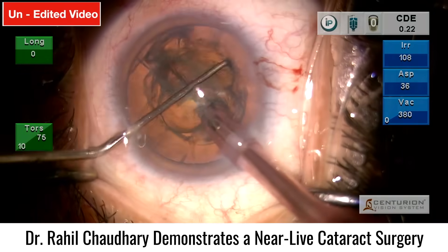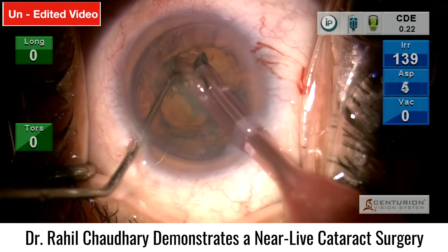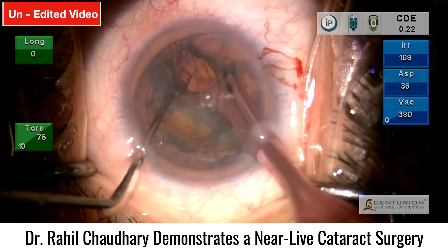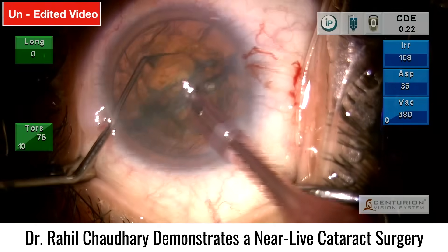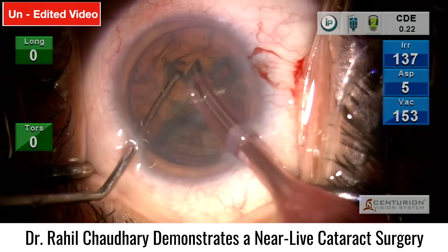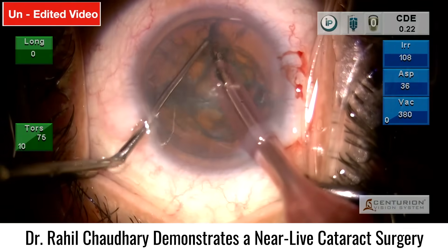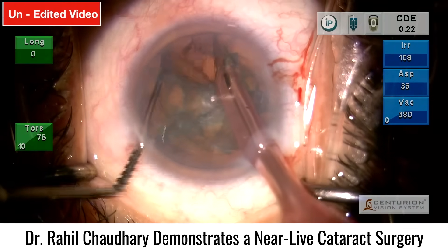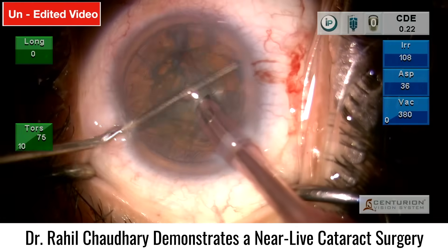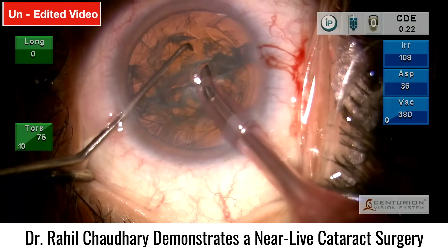The chop is completed to the mid-periphery, then completing this chop from the other side. The lens is now divided nicely into two quadrants. Further chopping and dividing into four quadrants — the next chop is taken, dialing, reaching to the other end and taking the last chop.